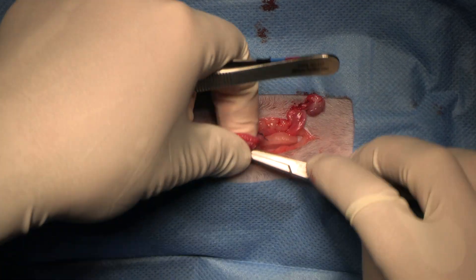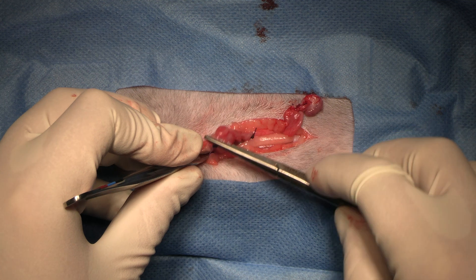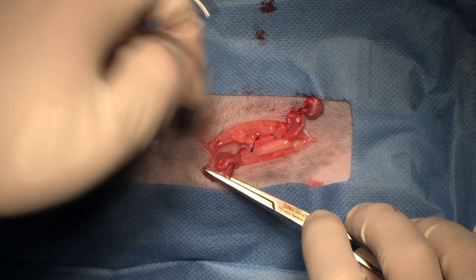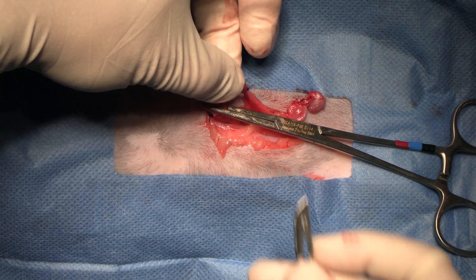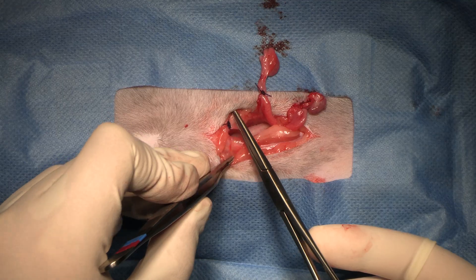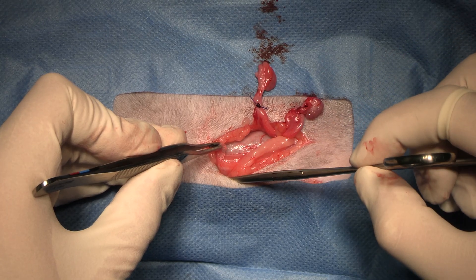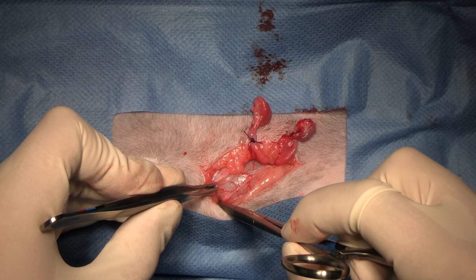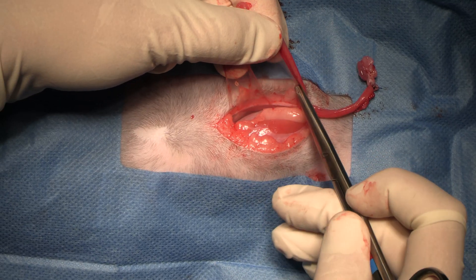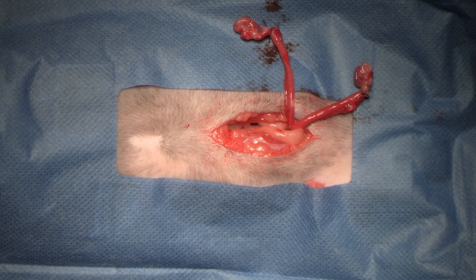Just like last time we do our check — make sure that our knot is not tied up at the top and doesn't have any retaining tissue in it, which it doesn't. We have a nice wedge of tissue above our knot and a nice ligature. We run our blade on the top of our hemostat. As always, we carefully lower our pedicle into the abdomen, watching for bleeding. We have a look at our broad ligament, make sure there are no vessels in it, which there aren't. We make a hole near our uterine artery and digitally or with scissors cut away.